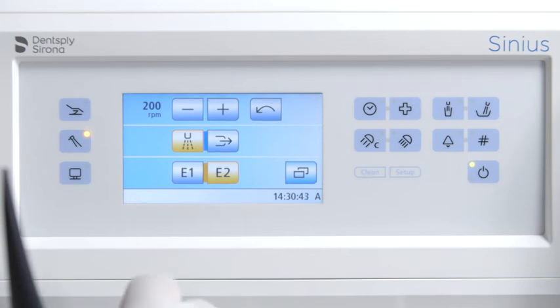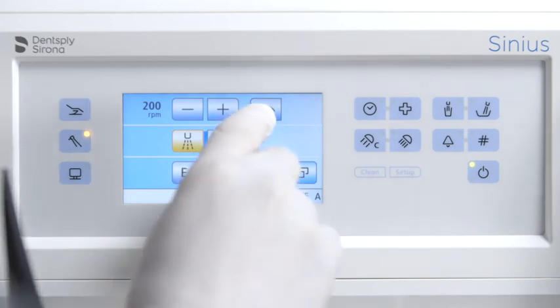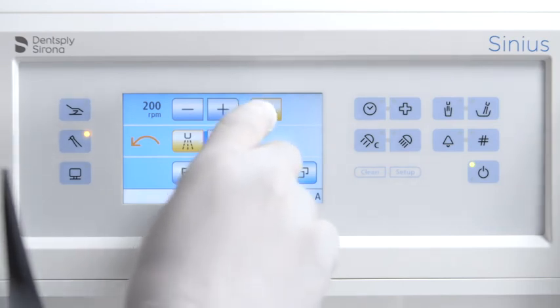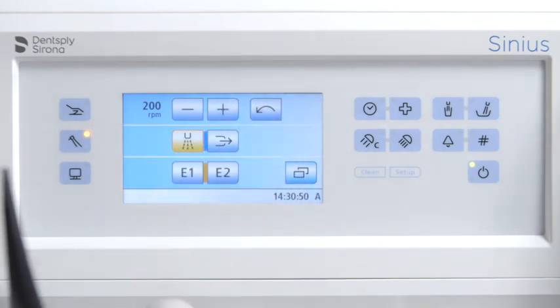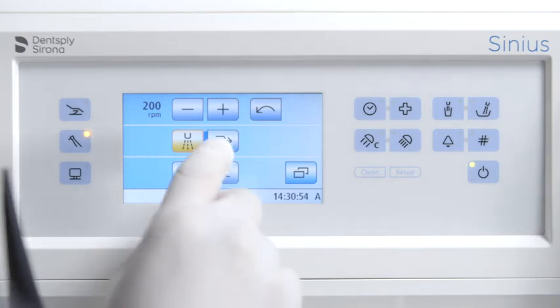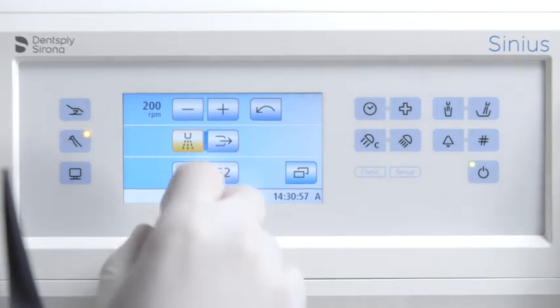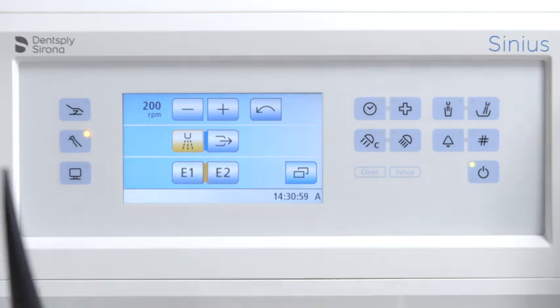Counterclockwise rotation can be switched on or off using the counterclockwise rotation button. The button is highlighted orange when counterclockwise rotation is activated. Use the chip blower button to dry treatment areas or blow off drilling chips by activating an air blast from the treatment instrument. This button is displayed only when cursor control is activated.